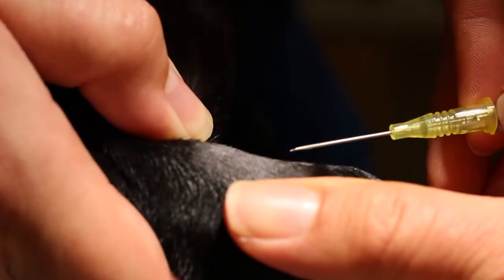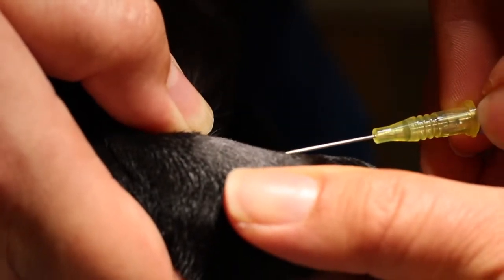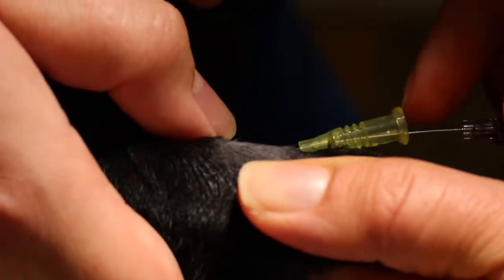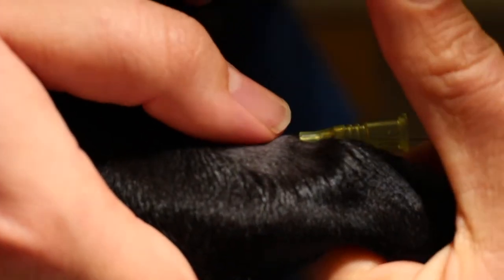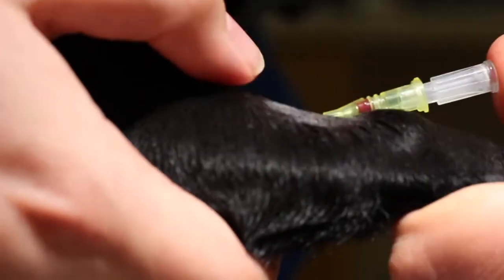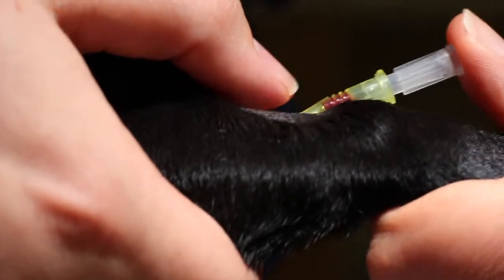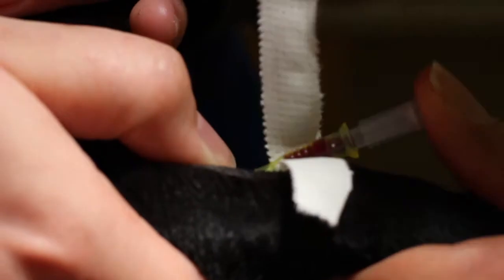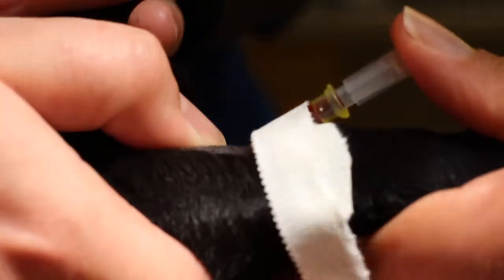Here you can see the angle of insertion of the stylet. It goes into the vein and then parallel down to the dog's leg as the catheter is advanced. Then a temporary plug will be placed here. The half strip of tape, sticky side up, is wrapped completely around the catheter so you have a good fixation of tape to the catheter and then tape to the leg.